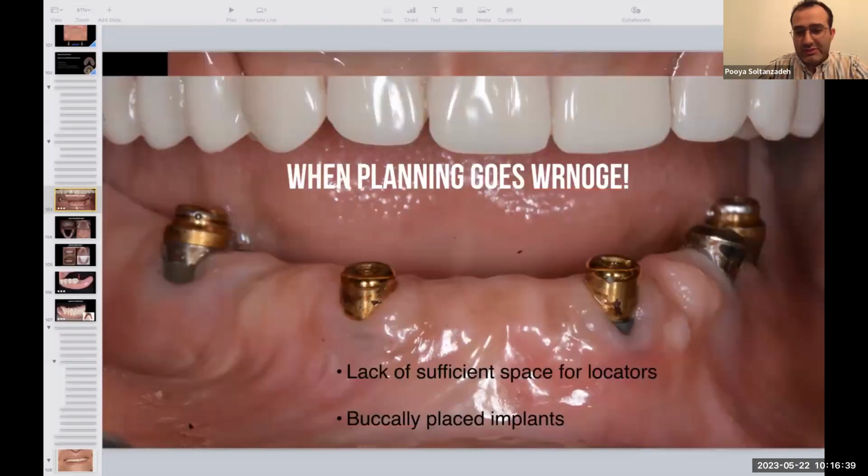Restorative space was very limited, everything fractured. The transition line was showing. And then the hygiene was not good either, and you can see concavity underneath it. And we have a lot of things. So what I did basically, because with the CAD/CAM dentures we have more strength, we can reduce this restorative space and make it stronger, but with less thickness. So this is what we did.